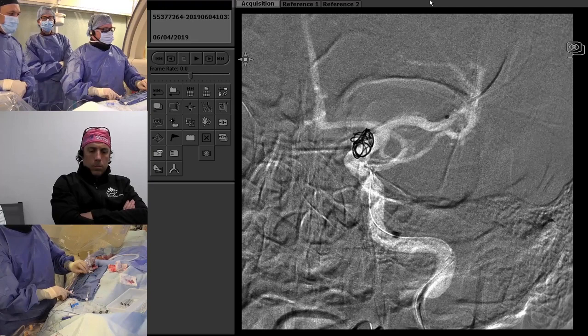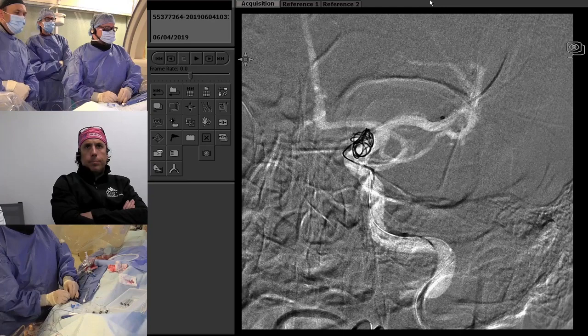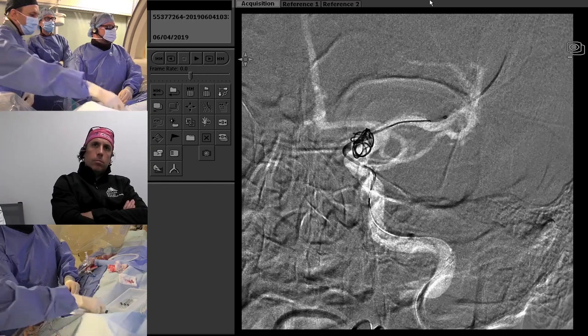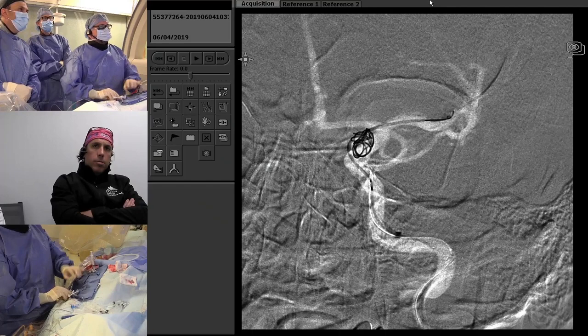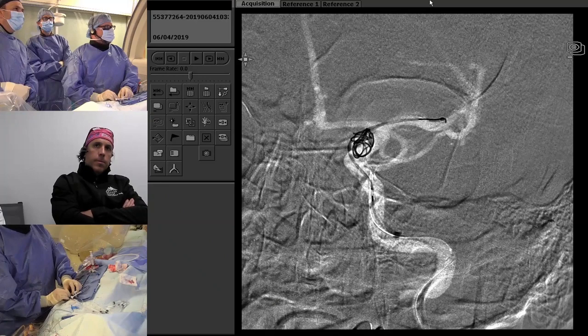I took a little bit of energy off so that the catheter wasn't quite so twisted, making it less likely that the pipeline itself would twist. The patient may move a little here because this is a bit discomforting. You guys are using biplane, correct? Just for technical reasons we only have one view for the stream, but we're looking at this in both views. That is correct.